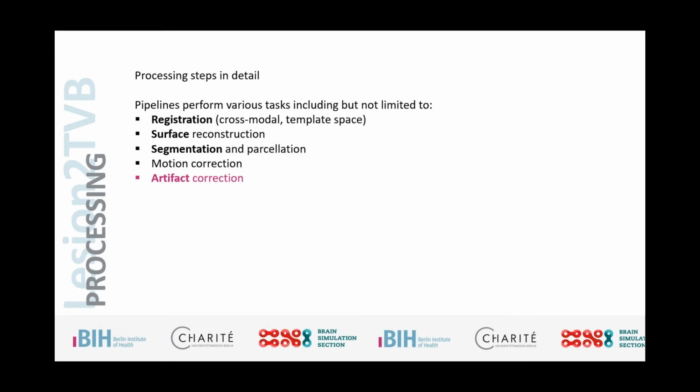The same goes if you want to register to a template space, such as the MNI template, to make different data types and different studies really comparable based on a common template. Then we're talking about surface reconstruction. I think we've seen this in one of the previous sessions as well, where in TVB we can also run surface simulations. So having an accurate representation of the surface of the subject is really helpful. And surface reconstruction is one of the main and most computationally expensive processing tasks that we want to perform.